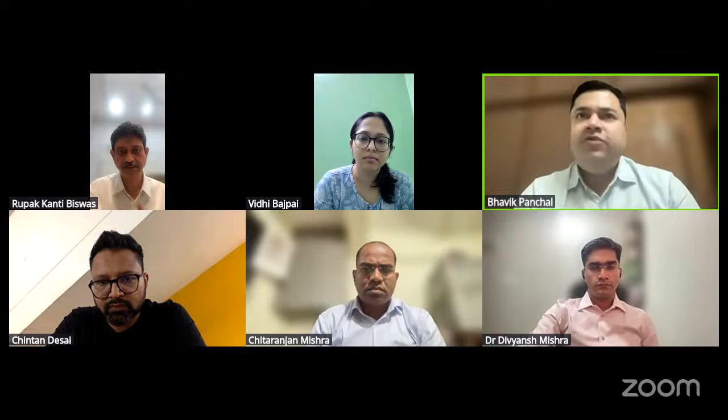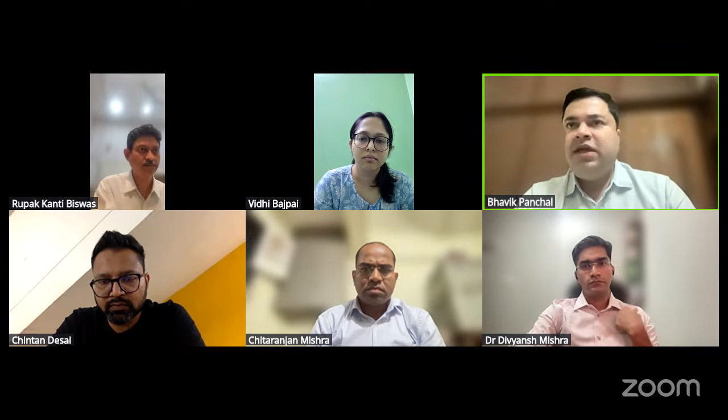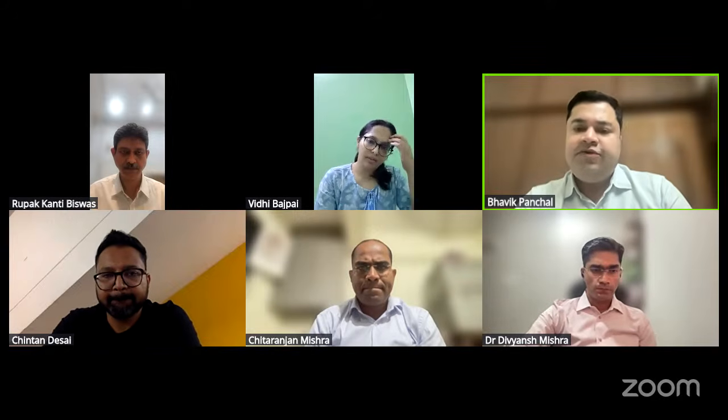Before moving on to further considerations about using PFCL or visco, staying on flaps, I have one more question. A very important, interesting point that Dr. Chitranjan mentioned about myopic holes. This question is for Dr. Divyansh and Dr. Chitranjan both. In myopic holes, do you wait for 400 microns, or even the smaller holes you want to close with the flap?